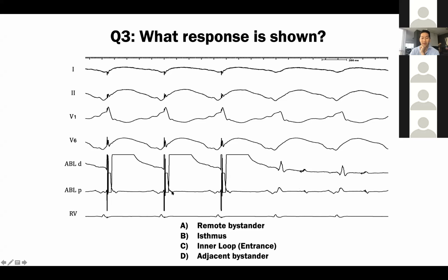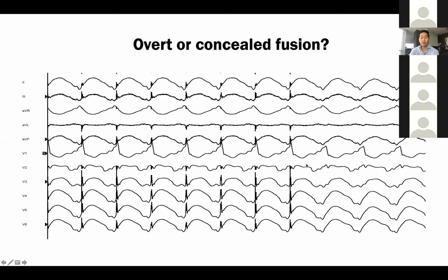which means I'm capturing something here directly and orthodromically capturing this pretty immediately after the pacing spike. So this proximal is actually the key to this puzzle, that it actually is capturing something around here and not this component. So this is the one that we're going to measure to.